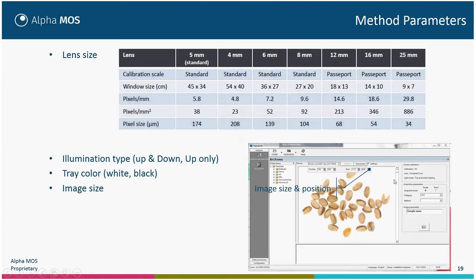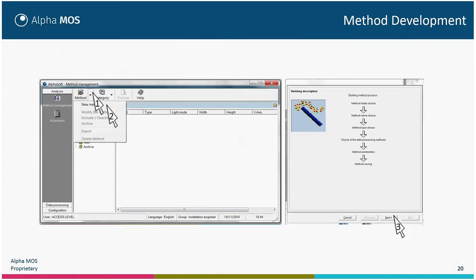You can have a computer zoom — it's not a real zoom, not an optical zoom. You can adjust the size of your image by clicking Settings and adjusting this slider or by setting the size in pixels in the image. This size, when set manually within the live image, can be retrieved when you create the method — the next step we will now see.